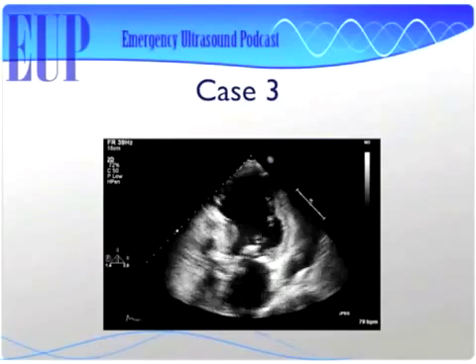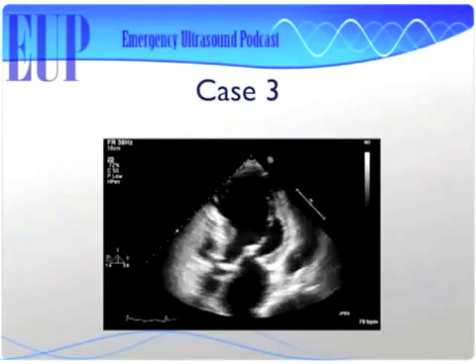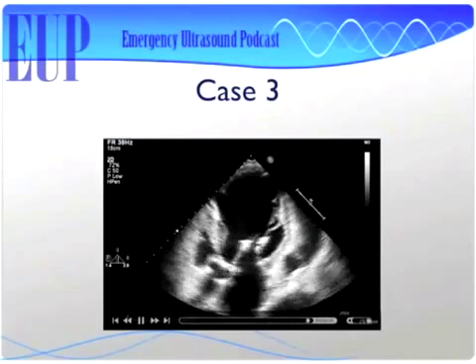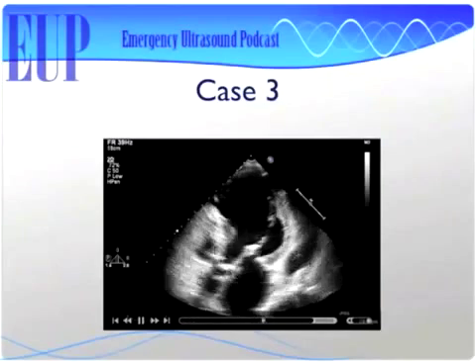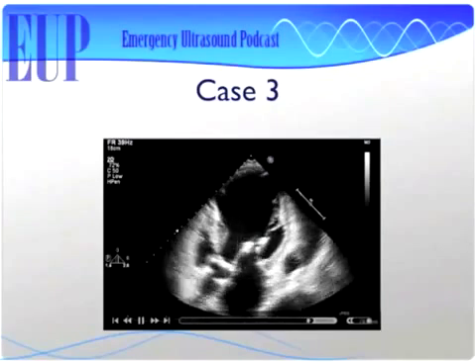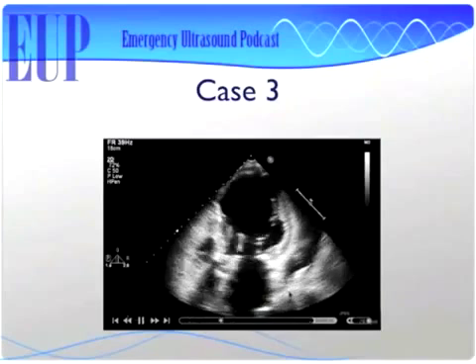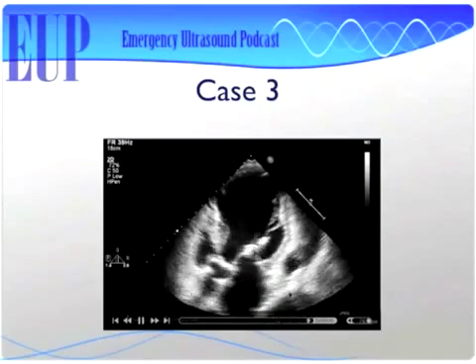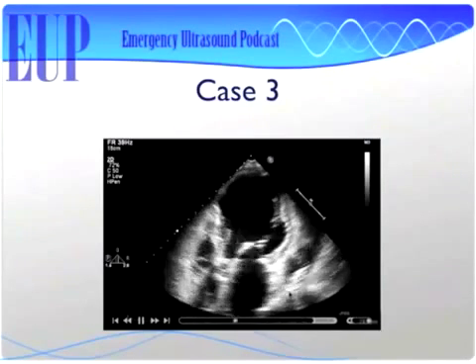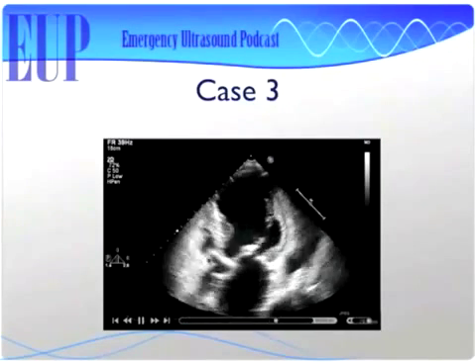So this is actually an apical long axis window. This is something that you probably don't really see that much unless you're just messing around with your apical window trying to find a 4-chamber. But what happens is you're seeing the LV here, right? And then this is the left ventricular outflow tract, and I know that because I see the aortic valve right there. And then, of course, this is the mitral valve, and this is the left atrium. So if you imagine, this is just like an end-on-end parasternal long axis view. You're seeing the exact same stuff, just from a different direction. You're looking at the parasternal long axis view from the apex instead of from the right ventricle. Make sense? Got it. And then here, this is actually our view right over here.